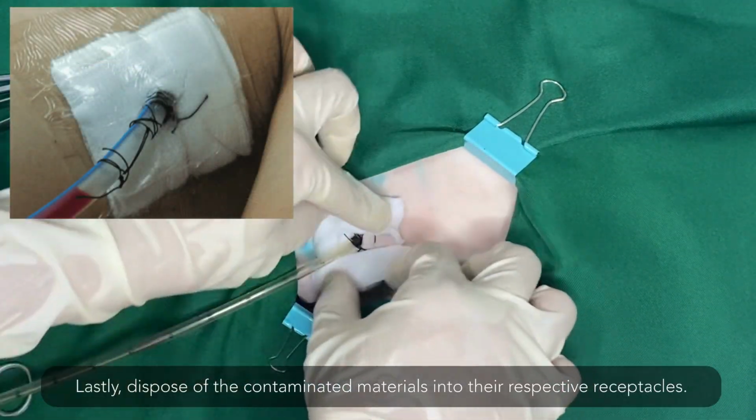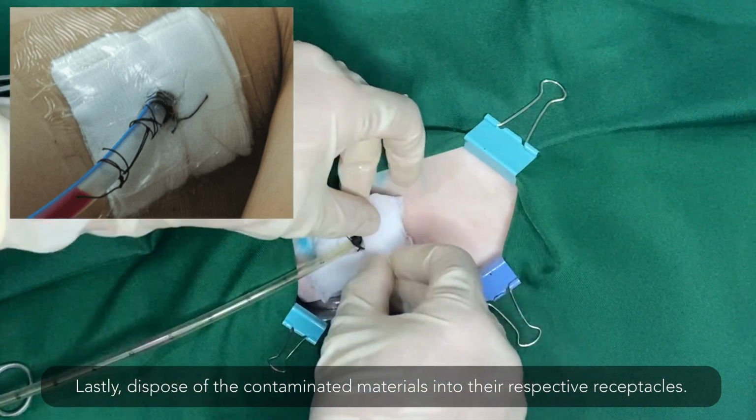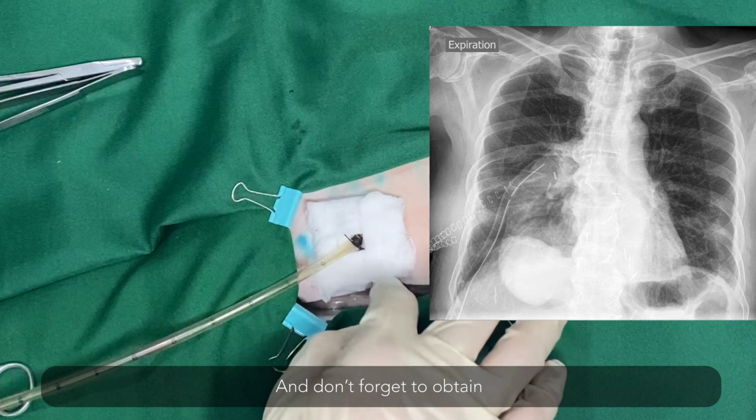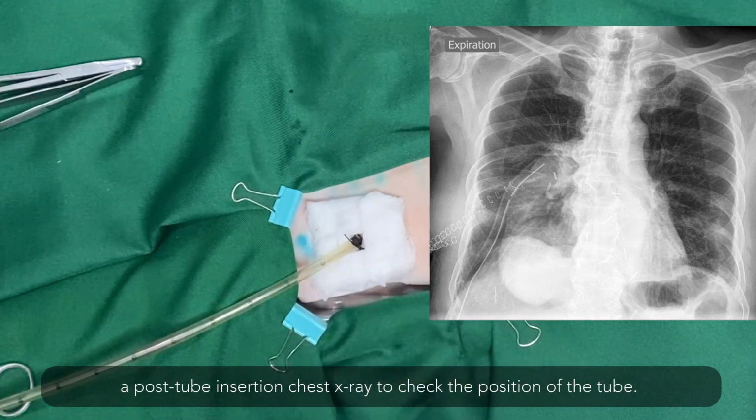Lastly, dispose of the contaminated materials into the respective receptacles. And don't forget to obtain a post-tube insertion chest x-ray to check the position of the tube.